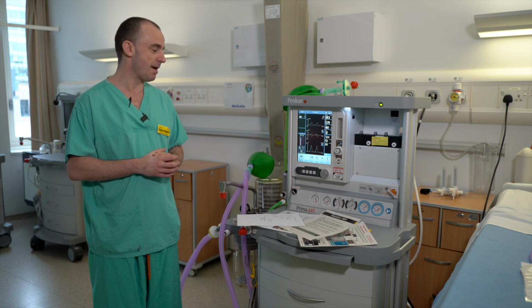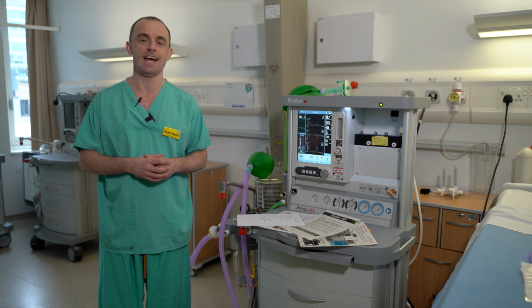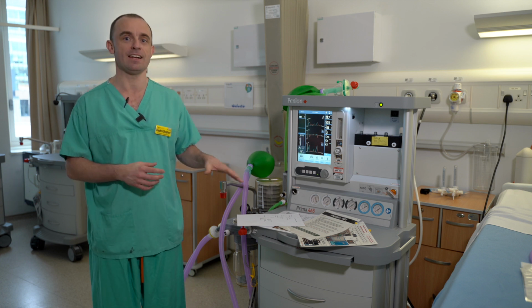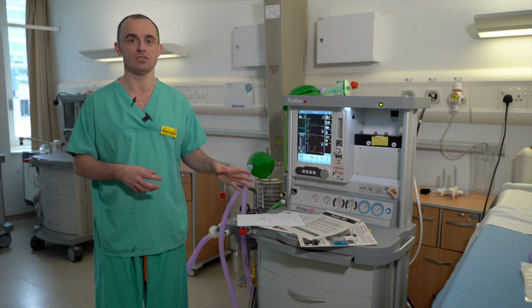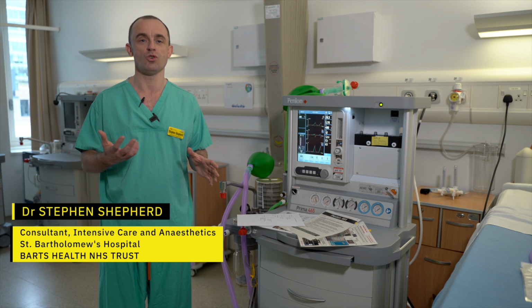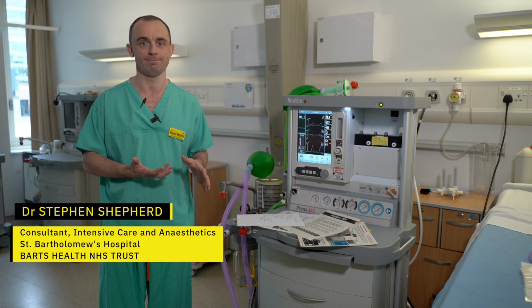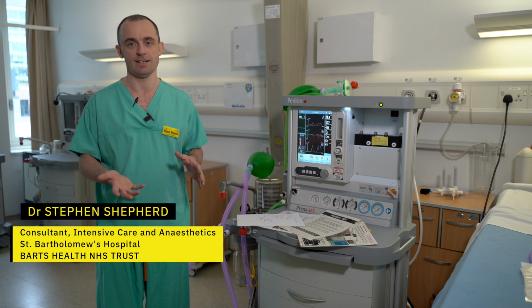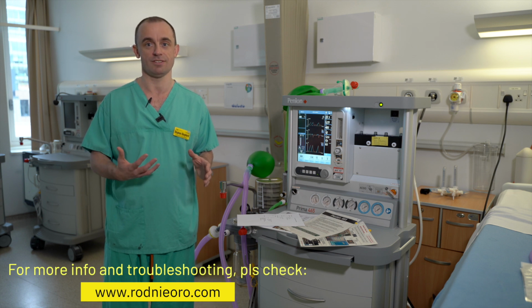And finally, unlike the other anaesthetic machines that we're using, these do not need to be recalibrated every shift. Once it's turned on, it can be left on, and you don't need to make any changes to any of the settings or do a repeat use check unless there is a clinical suspicion that the machine is not functioning properly. Again, that's unlikely and should be decided by an intensive care or anaesthetic doctor.